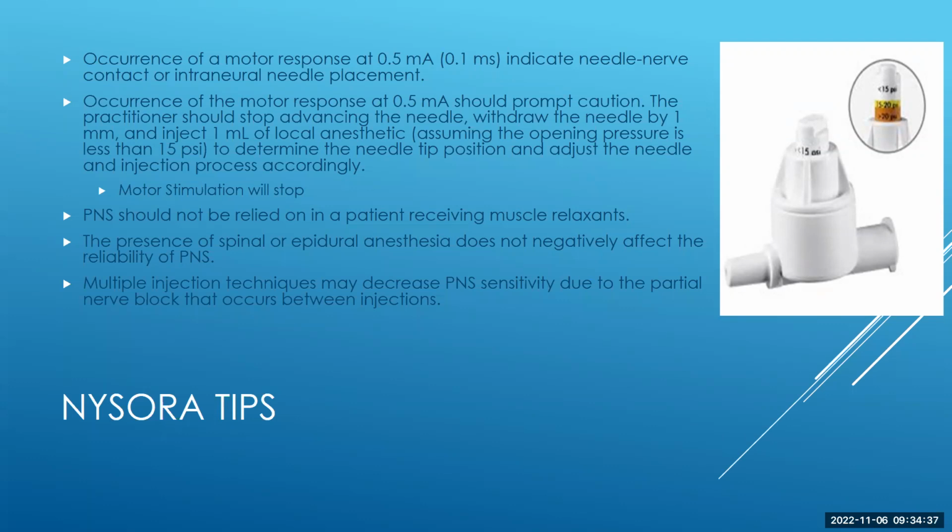motor stimulation. But if you're going to look for nerves and stimulation and they're in the same area, a good example is an axillary nerve block or interscalene approach, where you really want to get more local in different areas, especially with the axillary.